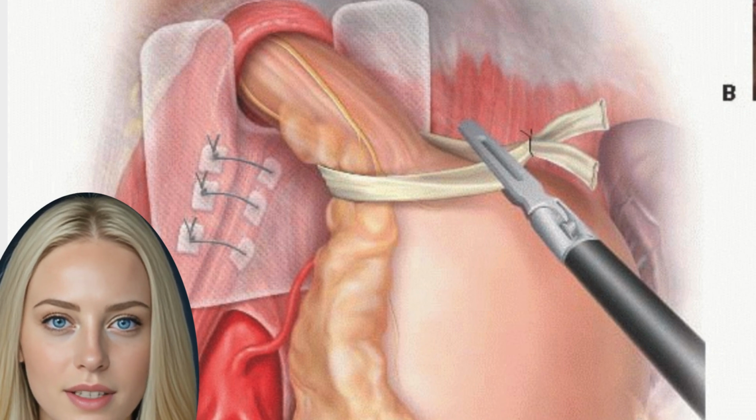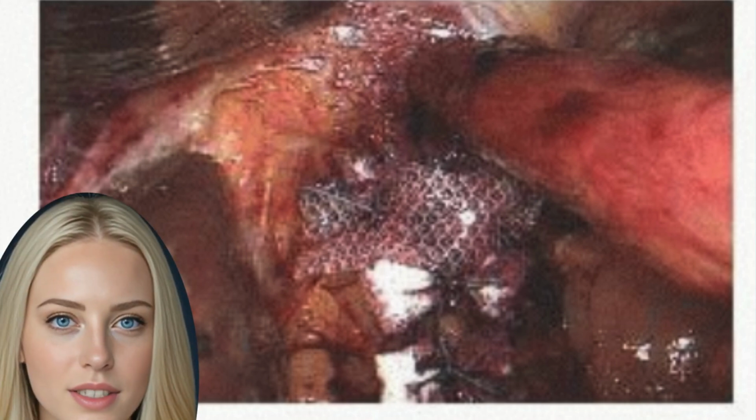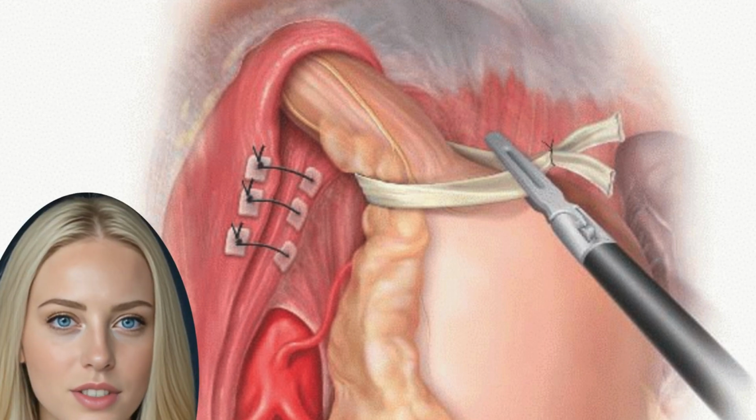Hernia sac excision. If properly performed, the hernia sac can be removed en bloc, as evidenced by the mediastinal component of the hernia sac being contiguous with that of the anterior esophagus and fat pad, Fig 13A-B, which may also need excision in order to properly perform the antireflux portion of the operation. If the hernia sac is large and will obstruct mediastinal dissection, excision of the sac is warranted.